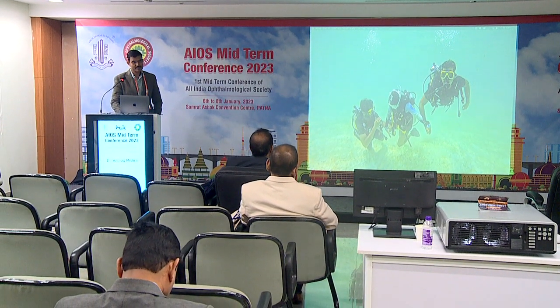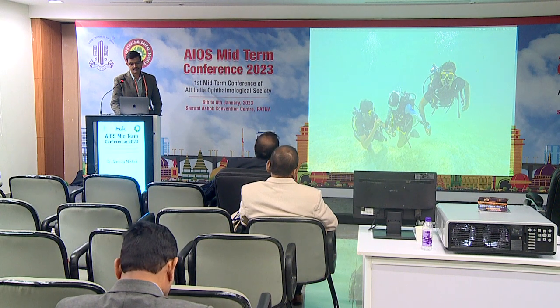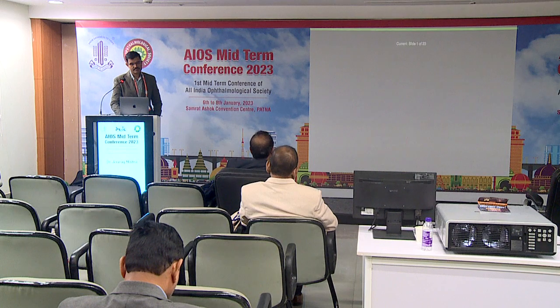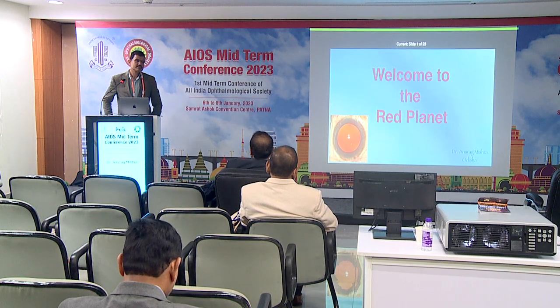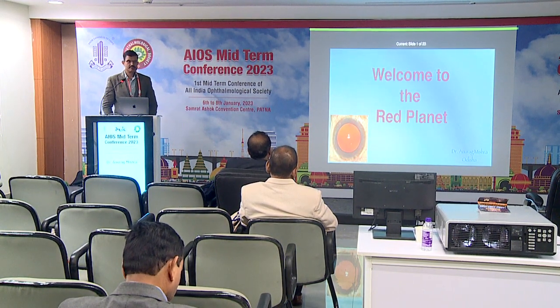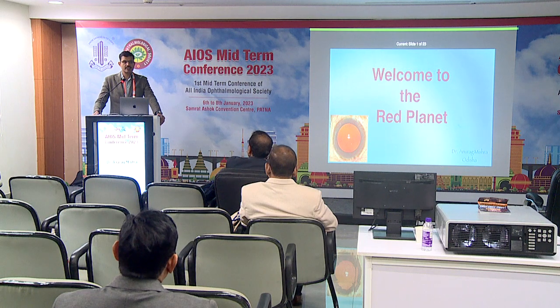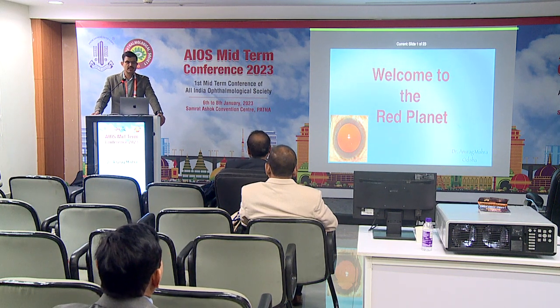Another very big advantage of this active fluidics is in those patients who have undergone vitrectomy. In this situation, with this much intra-IOP, we can avoid sudden deepening of the anterior chamber and other things, like the reverse pupillary block. It also works well with the high myopics. They don't complain of any pain.